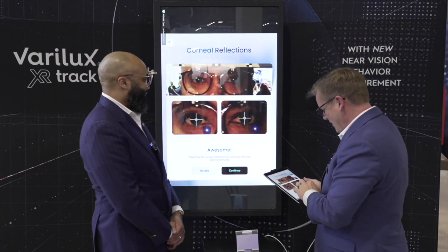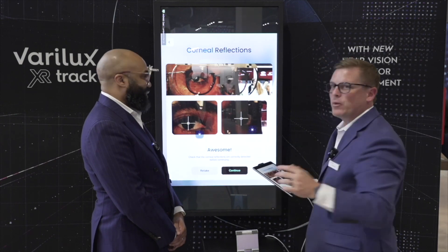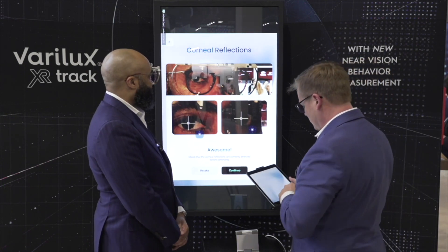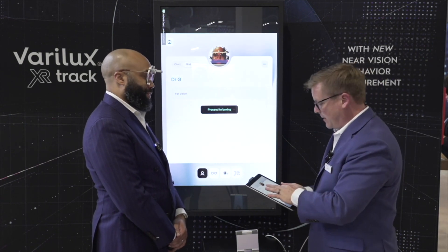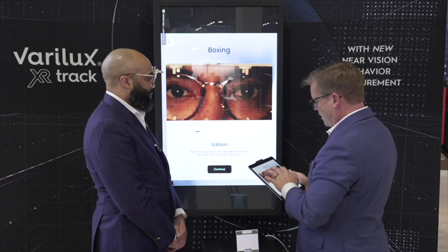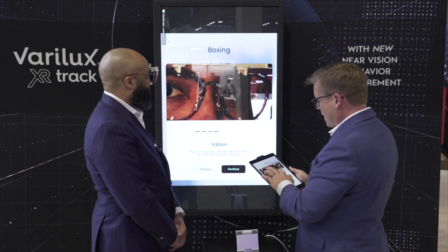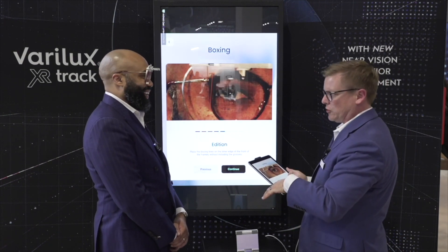We've got the corneal reflections captured on both eyes, even with this lighting. Obviously trade show floor lighting in Las Vegas is very different from what you'd have in your practice. Next, we go to the frame boxing step, where you line up the frame on the inside with the bevel. That looks good. It doesn't take long to learn — it's very quick and easy.